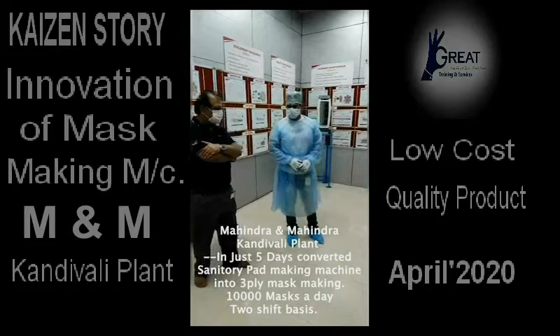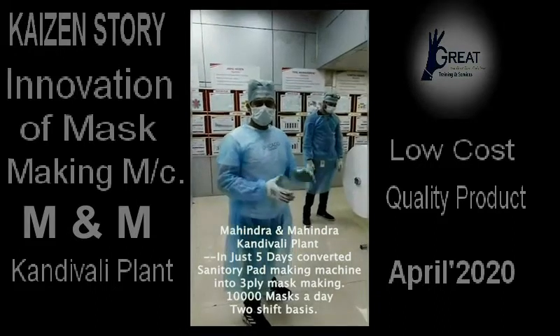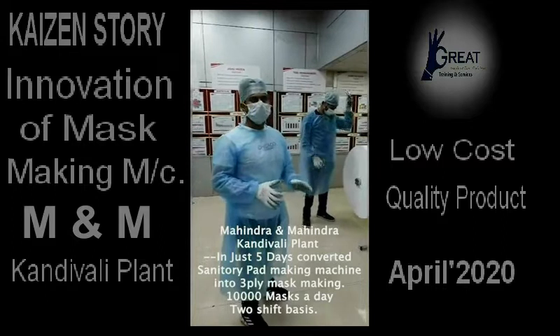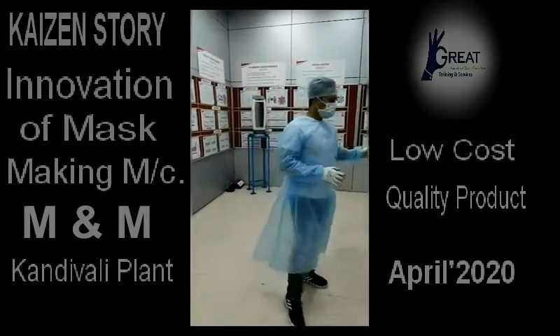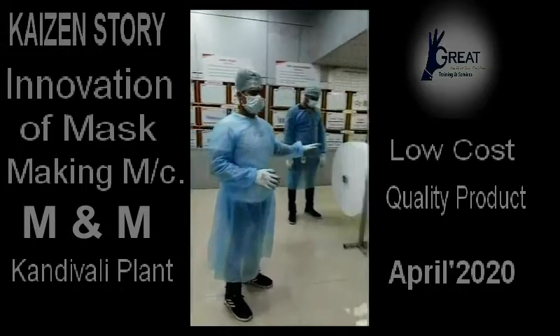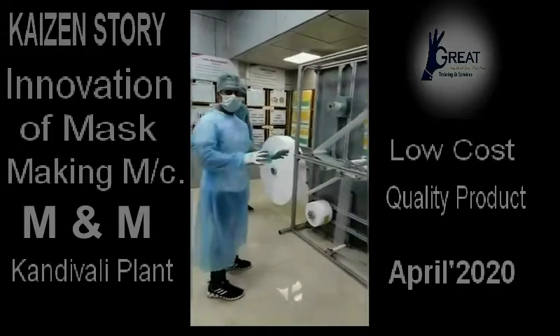I am Mohamad Rajas and I am from Saral Designs, and now I am at the Mahidat Kandivali location. This is our mass manufacturing machine. I will take you through the process of how it is working.